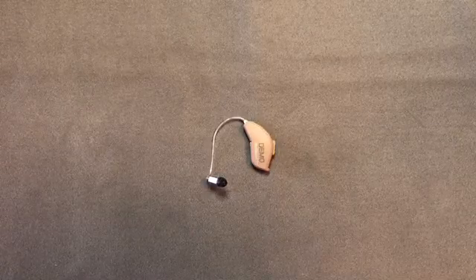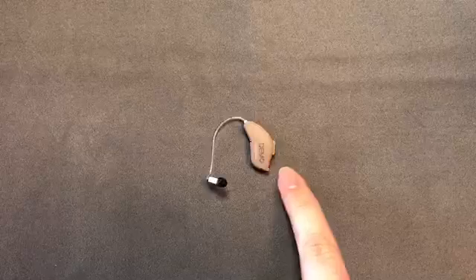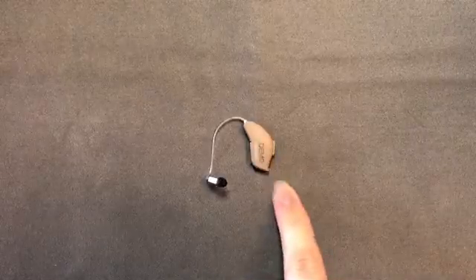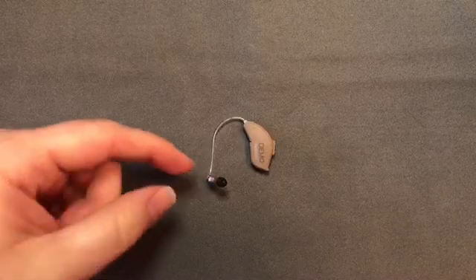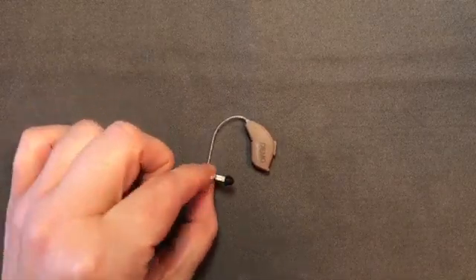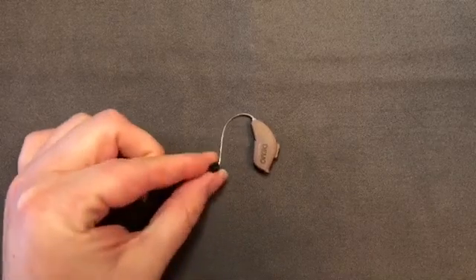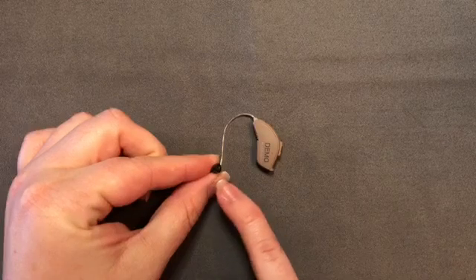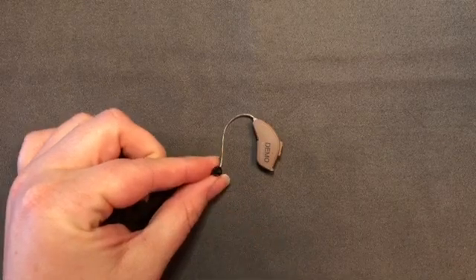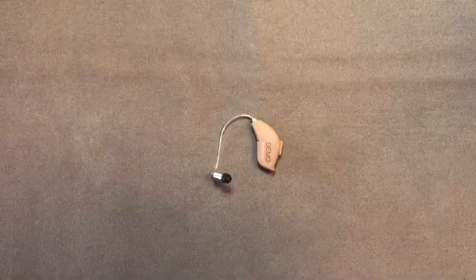For the receiver-in-the-ear style, most of the electronics of the device are in this beige piece that fits behind the top part of the ear. There is a wired connection that runs down to the receiver box that sits inside the ear canal. At the tip of the receiver box there is typically either a little dome that is not customized to the patient's ear, although there are different sizes that dome could be, or there could be a custom ear mold on the end of the receiver.